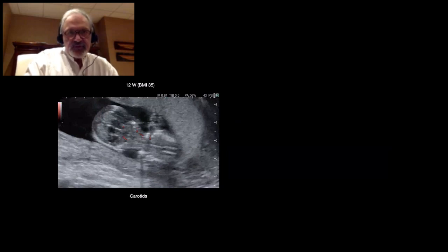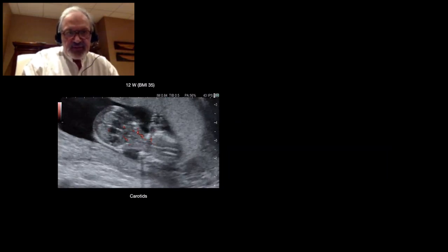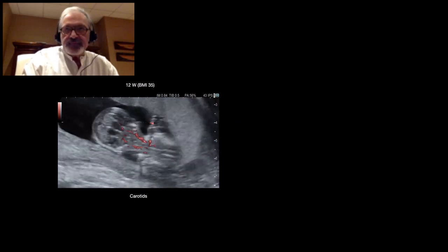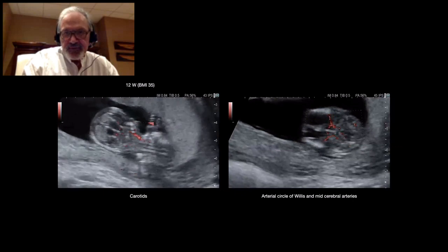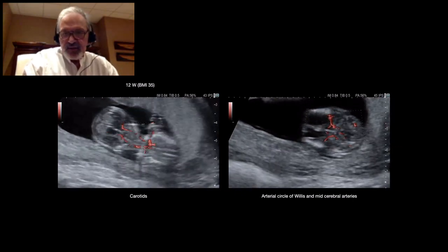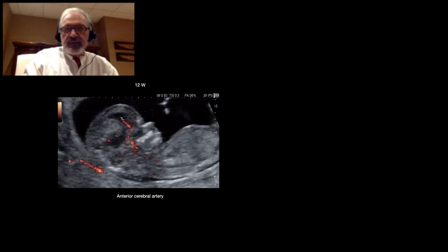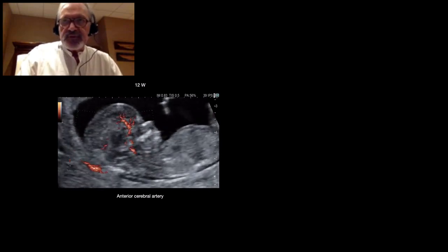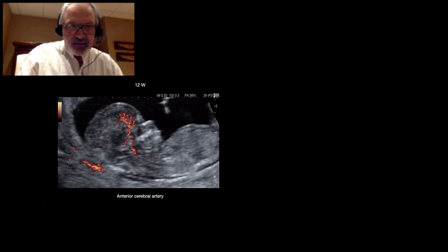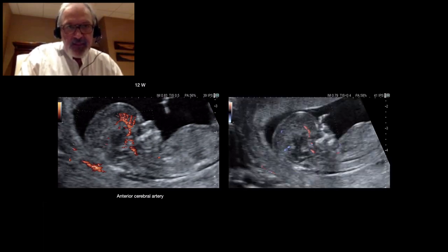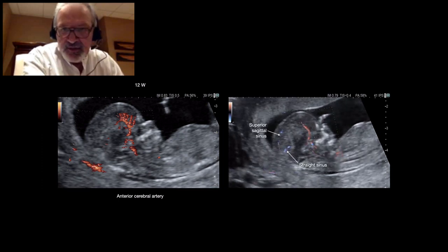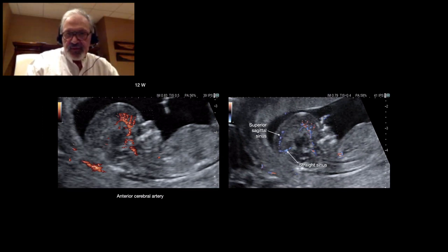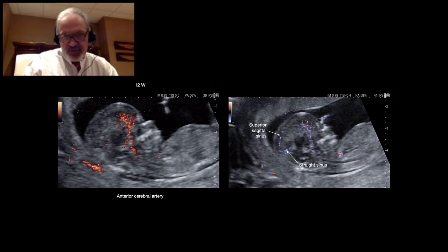In the same condition, with BMI of 35, we can see the carotid. Here in a transversal view, we have the circle of Willis and the two mid-cerebral arteries. Under normal conditions, the information is more accurate. You can see the anterior cerebral artery and its frontal branches, as well as the superior sagittal sinus and the straight sinus — very, very tiny vessels with very, very low flow — and we can see them.